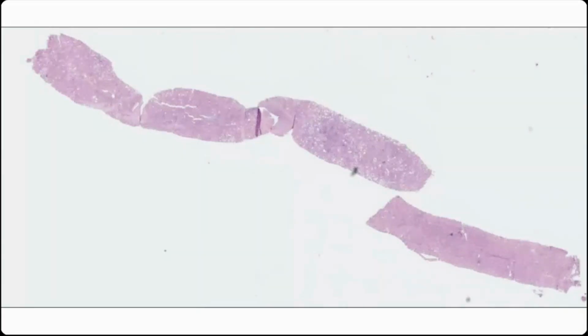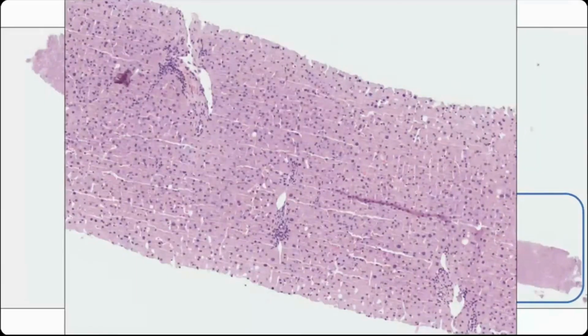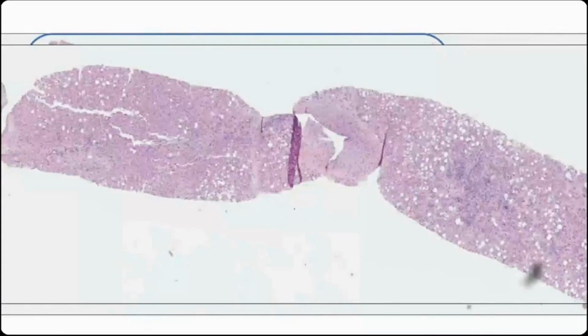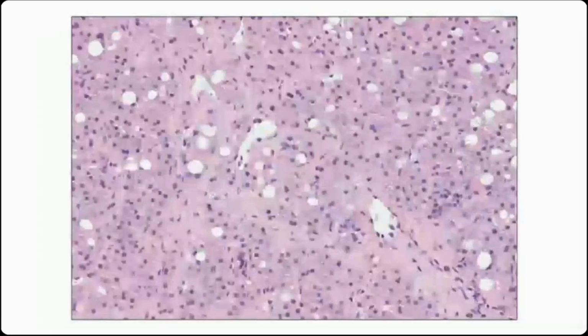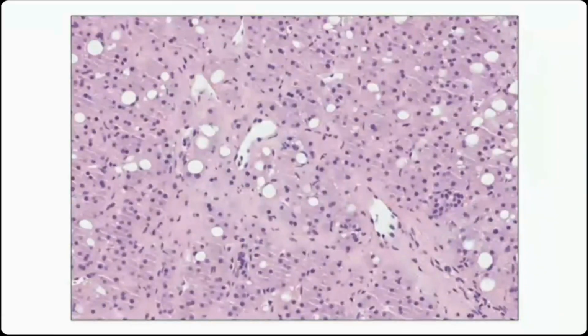This is a core biopsy. It's not the greatest. Here you have background liver, and here you can see this fatty or pale looking lesion. And this is the background liver at higher power. See the normal portal tracts. And when we look at the lesion, we see background steatosis, but these large, thick walled vessels. The lesional liver has these small unaccompanied arterioles, which are very important in targeted liver biopsies to know you're actually in a lesion. It can be very hard to identify.